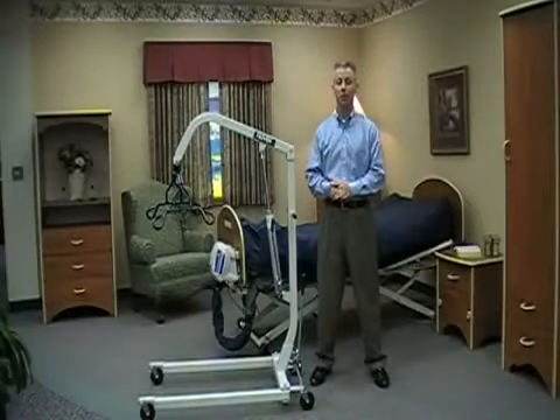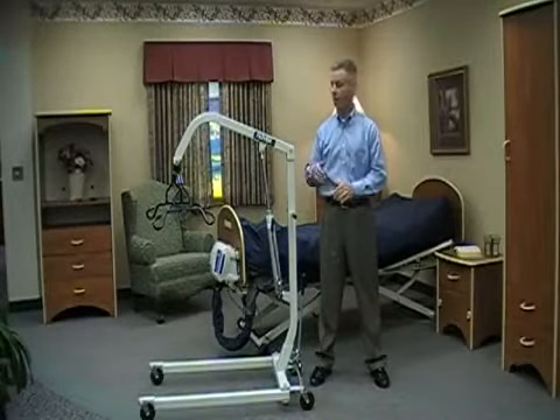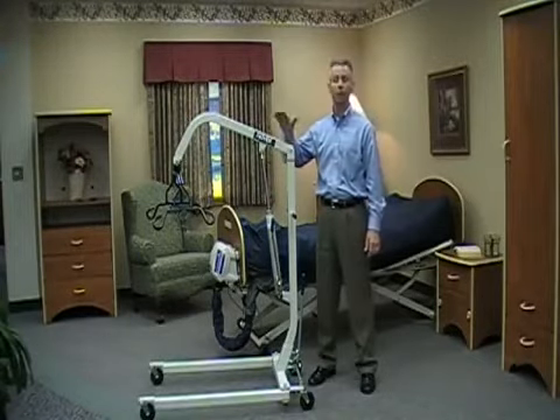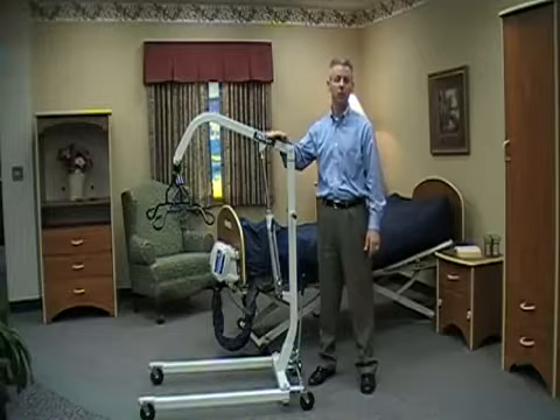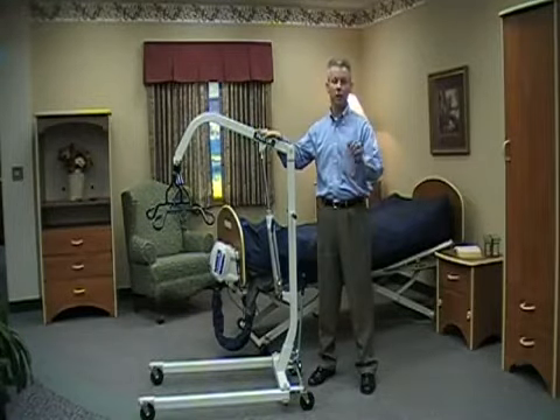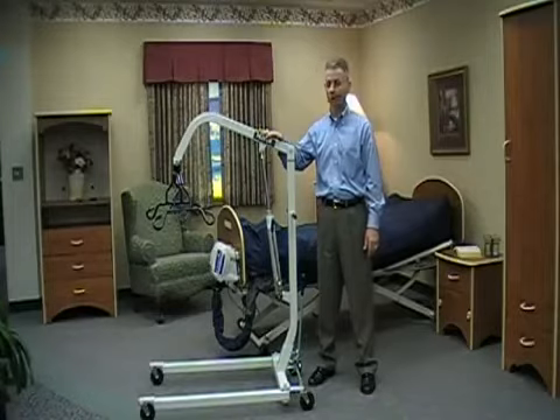Hi, I'm Grant Montgomery from Jerns Healthcare. I'm going to spend a few minutes with you discussing the Hoyer HML 400. The HML 400 is a hydraulic patient lift capable of lifting 400 pounds, so up to and including a 400 pound resident. In addition to the video that you're going to watch, we recommend that you review the user manual and operator's manual as well, so that you have a full working understanding of how the HML 400 operates.